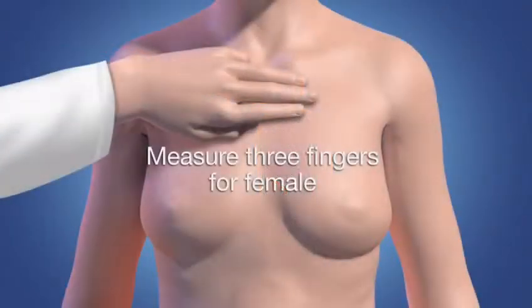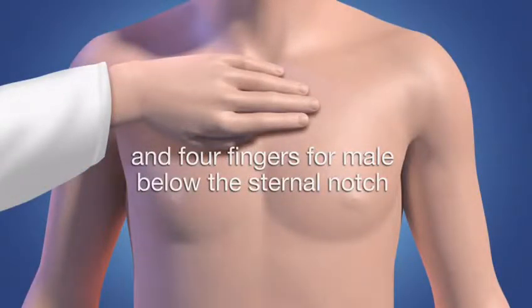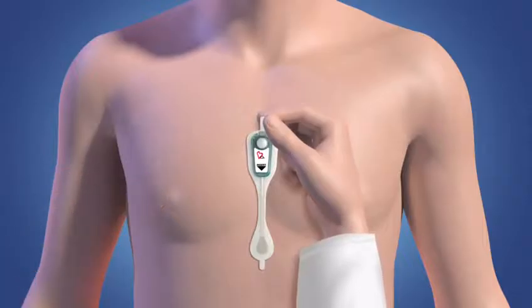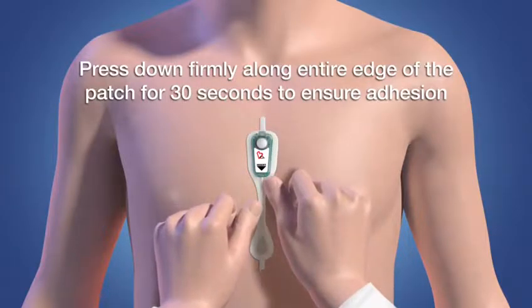For placement, measure 3 fingers for female and 4 fingers for male below the sternal notch. The bottom pole of the CAM should be over the xiphoid. Press down firmly along the entire edge of the patch for 30 seconds to ensure adhesion.